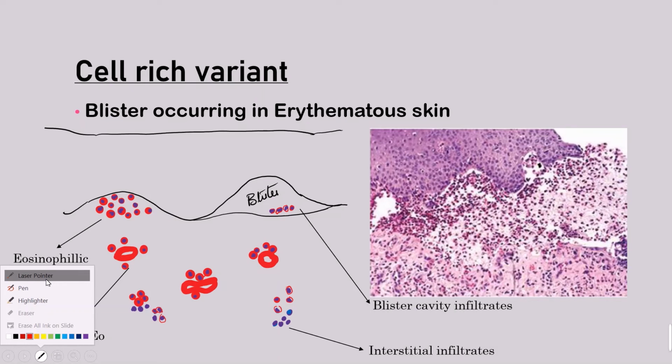And so the blister is cracked between the basal keratinocytes and the dermis, and the immunofluorescence pattern will be retained in the roof or roof plus floor, because hemidesmosomes are present in the basal keratinocytes, and collagen 17 is attached to basal keratinocyte. So it can be roof or artifactually roof plus floor.